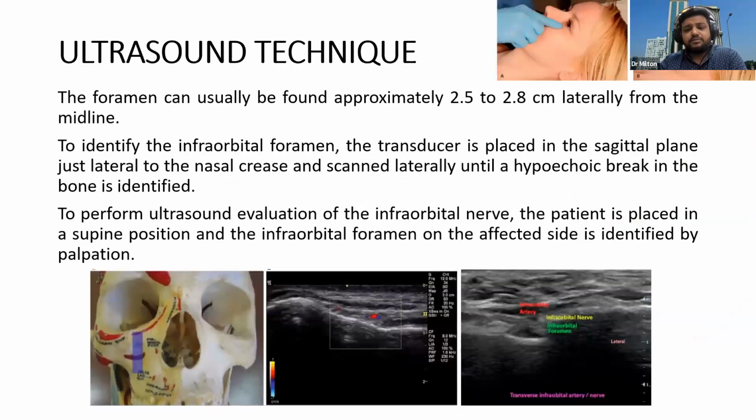So here it is the same thing. Actually, it is just below the eye. Here we found that from the middle to here it is around 2.5 to 2.8 centimeters from the midline.